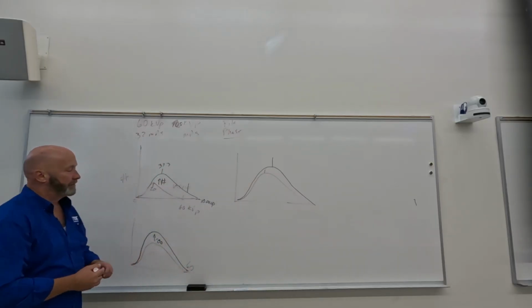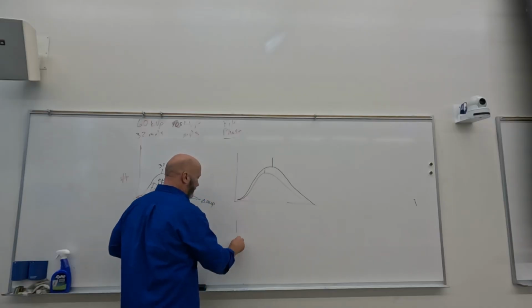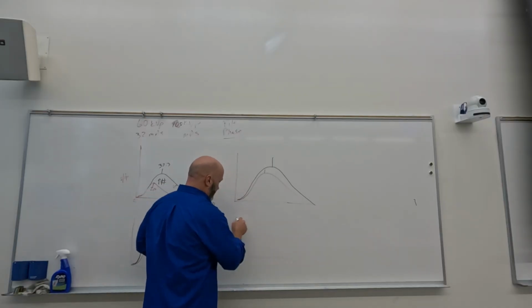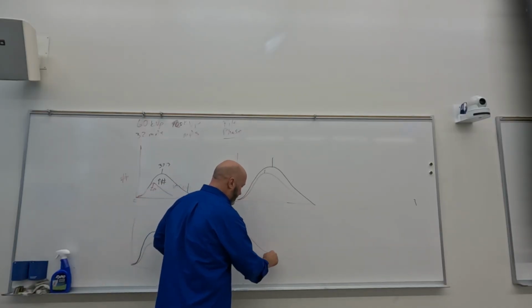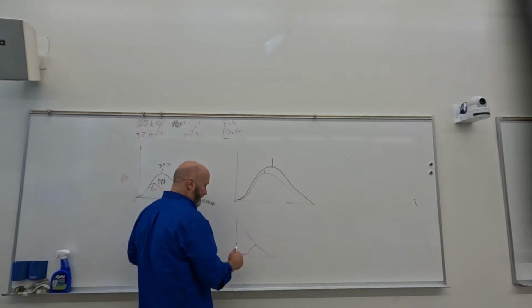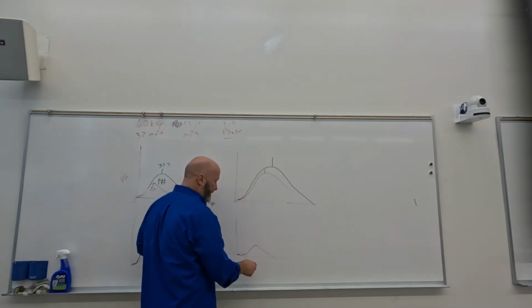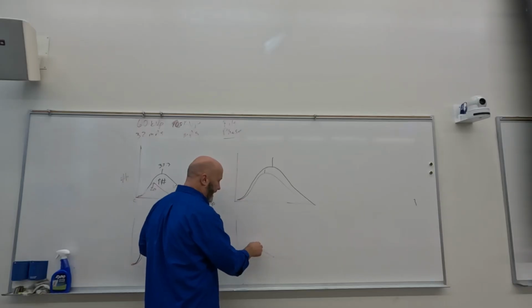Okay, so then we've got filtration, which I kind of already drew over here. Unfiltered X-ray beam looks more like that. You go through the glass, you go through the oil, you go through the mirror, and each one of those drops the numbers, so you get a decrease in numbers, but you get an increase in average.